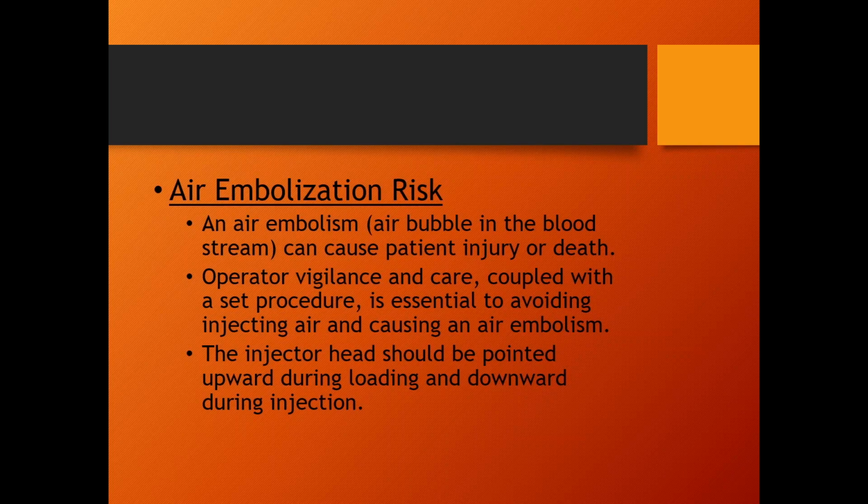For contrast injectors, they really don't want the injector to stop in the middle of a procedure, because if you think about it, we're in the X-ray department. The patient's on the table. What, other than this contrast fluid, what else is getting fired into this patient right now? Radiation. So if my injector stops, that means all the radiation we fired at the patient was for nothing. So that's total extra patient dose. So they are very diligent about making sure there are all sorts of checks and balances and no air bubbles in the syringe, because they really don't need it to shut down or abort the injection in the middle of the procedure.